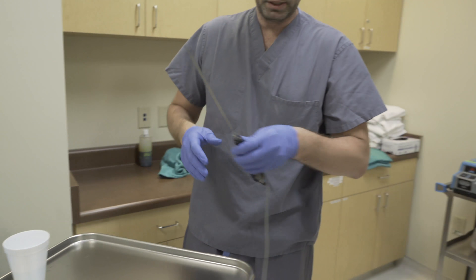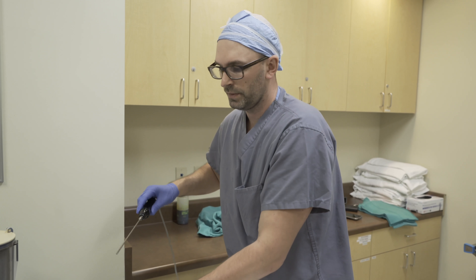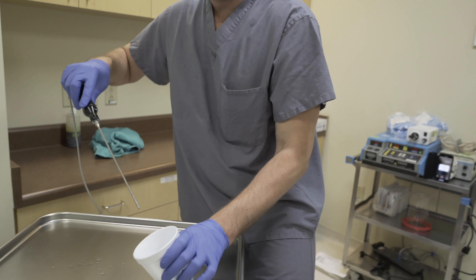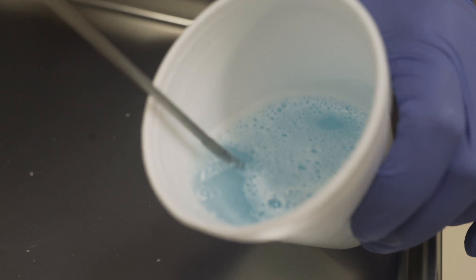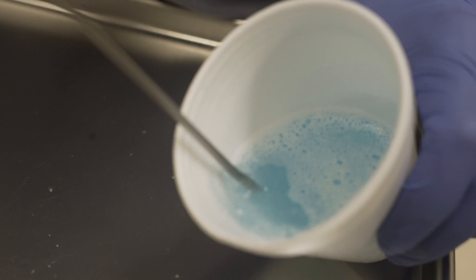Once we do that, we move to the ultrasound, or the VASER — this is technically a brand name. You can see we have some blue water with soap in it so you can actually watch the process. This breaks the fat up and causes bubbles, and those bubbles are what gets the fat to totally break up and become free without injuring the surrounding skin, muscle, or blood vessels.